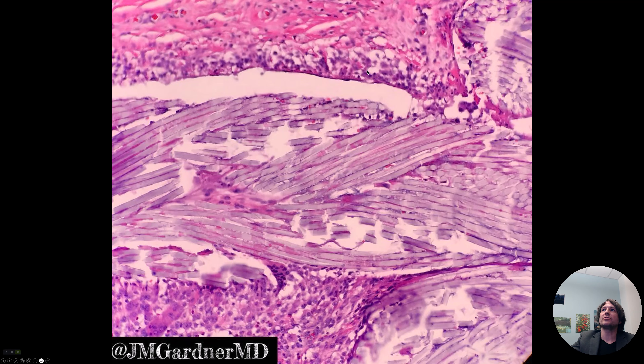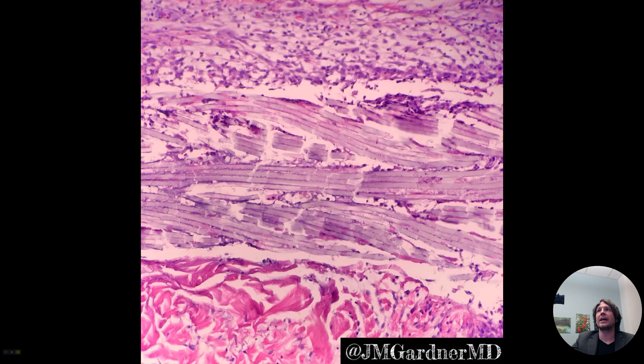And around them there's reactive change and histiocytes and neutrophils. Look — a foreign body giant cell down there. And that's another look at it, the same thing.